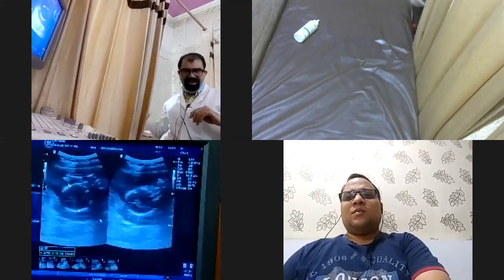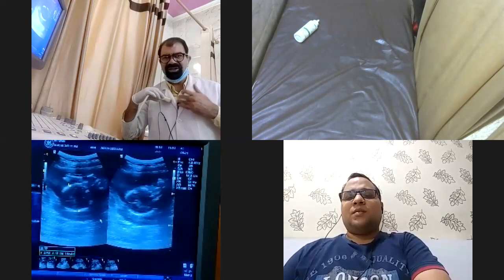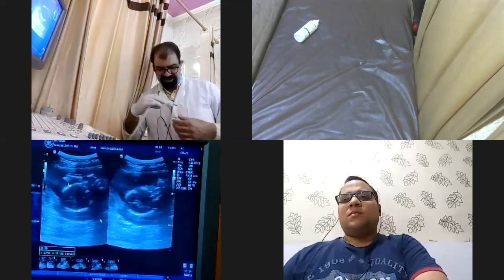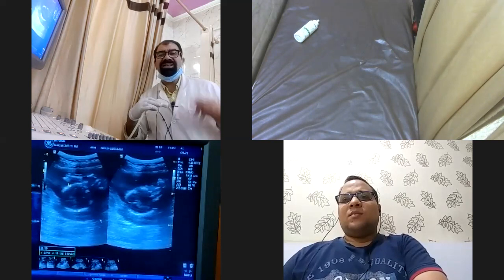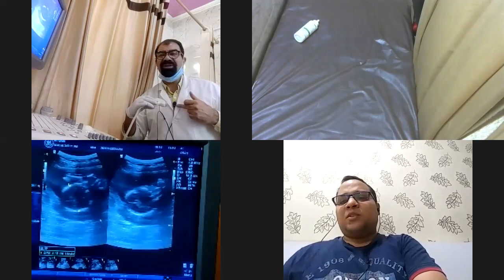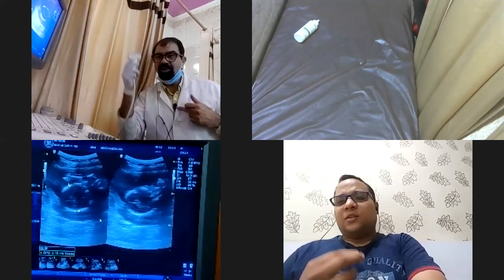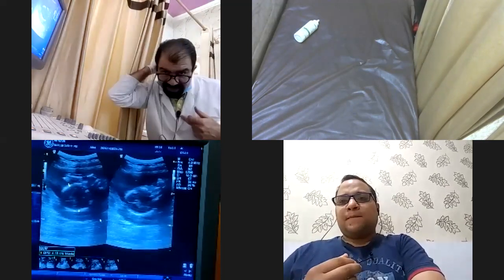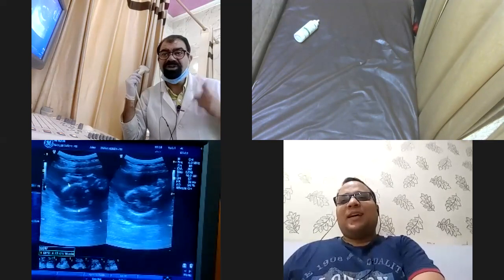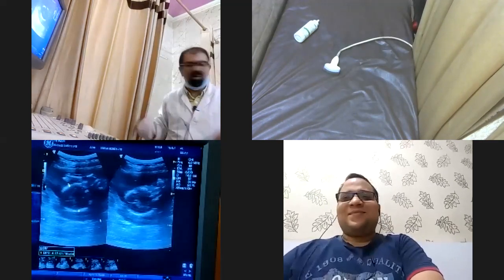Now, coming to your confusion. Now see this mic over here. This mic will be on the top or in the bottom of the screen if I will put probe over here? Top of the screen, sir. Now this probe, if I will put on my back, and I will scan from the back side, where this point will be now, on the top or in the bottom? In the bottom, sir. Have you got your answer? Yes, sir. God bless you.